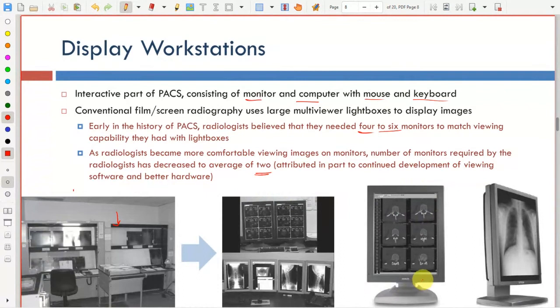Basically, these monitors are not regular monitors. If you buy a computer monitor for maybe 1,000 riyals, something like that, you can actually get one of these for maybe 20 to 30,000 riyals, at least. Okay, they are much more expensive.